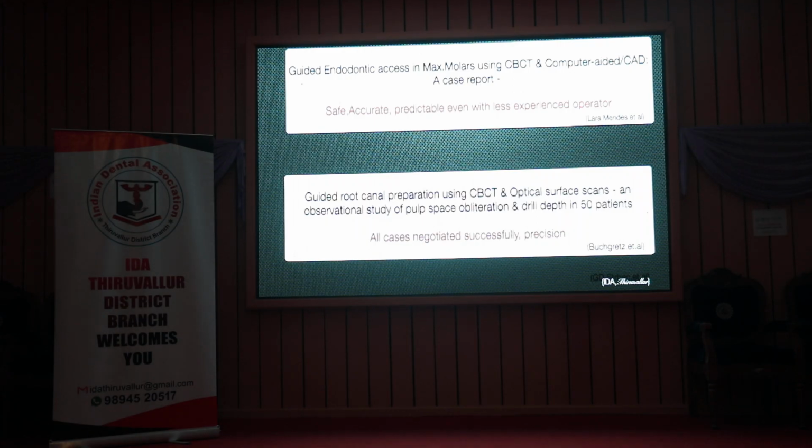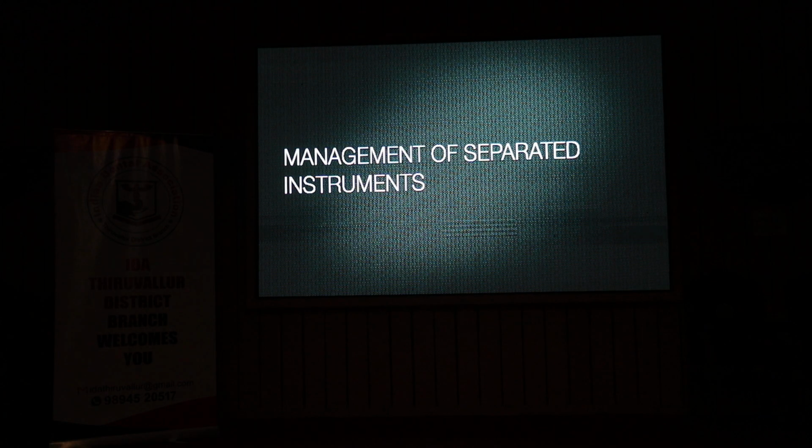And with this guided access, if you look at it, even an inexperienced operator is able to do the procedure safely. There is a lot of evidence in the literature, because most of the time you just cannot wait for the specialist to come and do the access opening. Fine. So far so good.